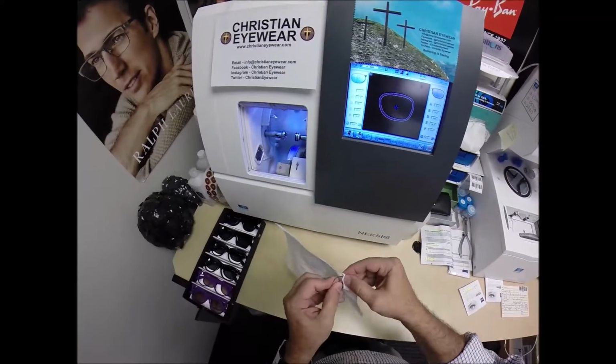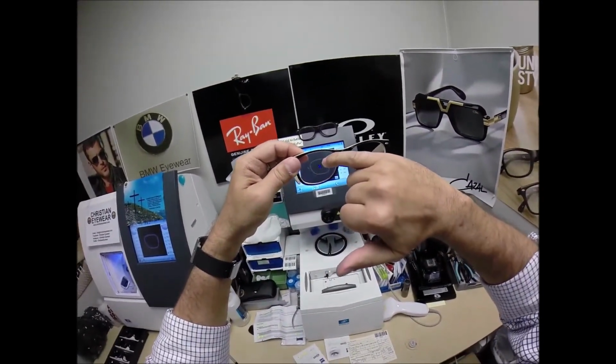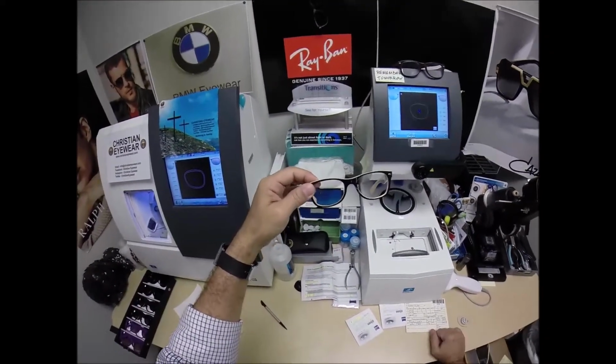All right, so I'm gonna dry everything off. I always like to remove that inside dot. So, where did the frame go? Here it is. So, it starts off at plus 75. It's called a progressive lens because as you look downward, it progressively gets stronger and stronger. And I can't remember if you said you've used progressive lenses before.